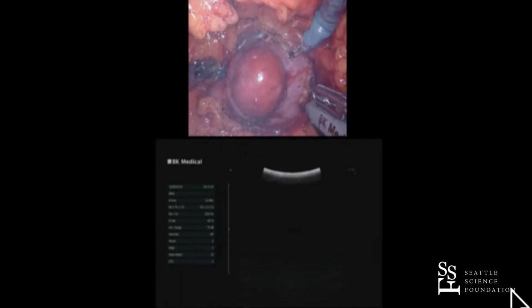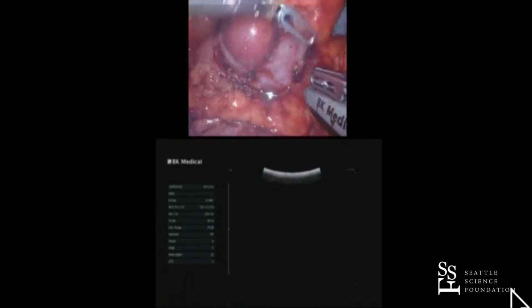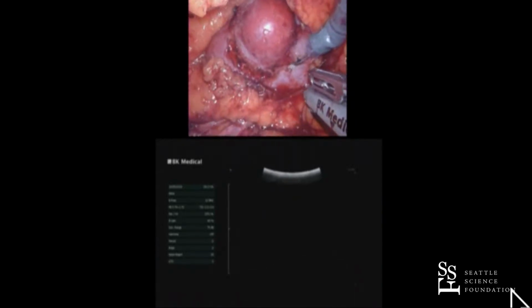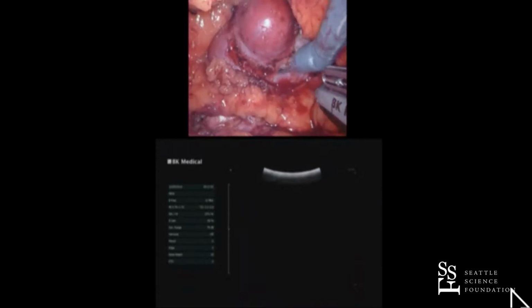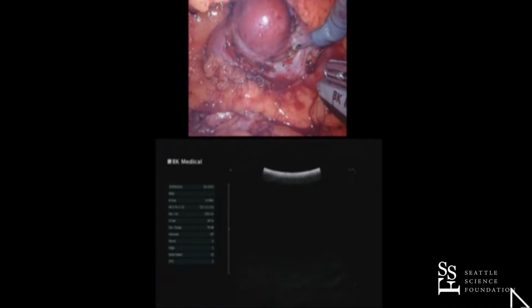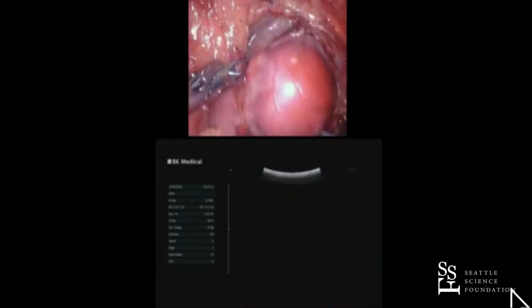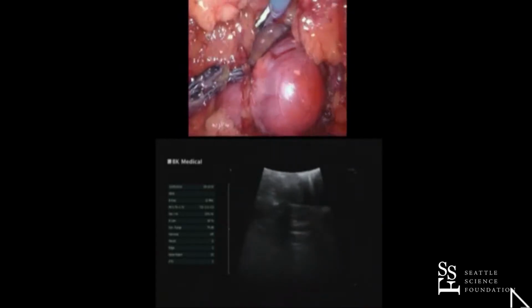So Jim, question from the audience while you're doing that. Post-ablation partial, so salvage partial, what are the challenges with that? You mean after ablation? Yes. Well, we've done partials after somebody's already been in there doing a partial for positive margins. And I tend to go, you want to get a negative margin the second time around. So we tend to go wider, and we try and spare what we can, but in general, we're not there to try and spare kidney. And of course, the wider you go, you get a little farther away from the reaction, and so that makes things a little more doable as well. So we tend to go a bit wider on these redo surgeries.